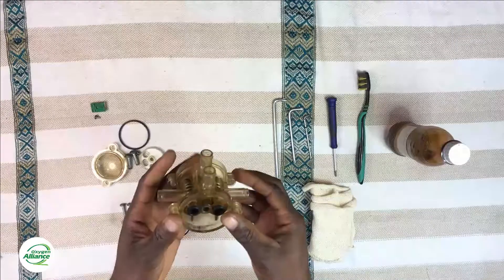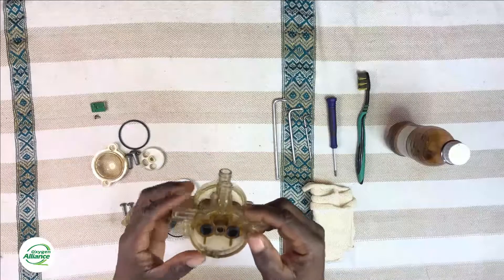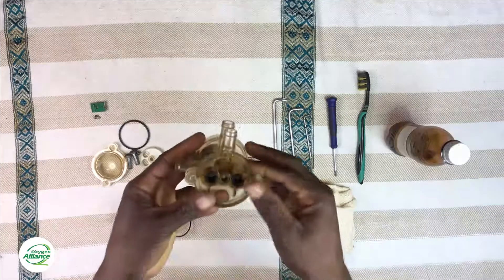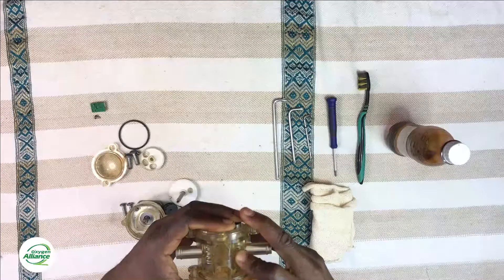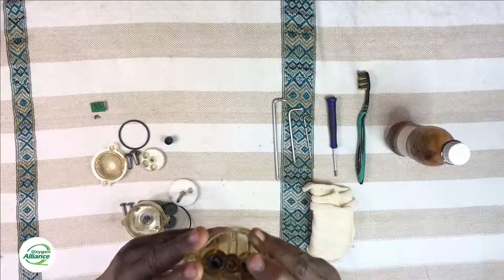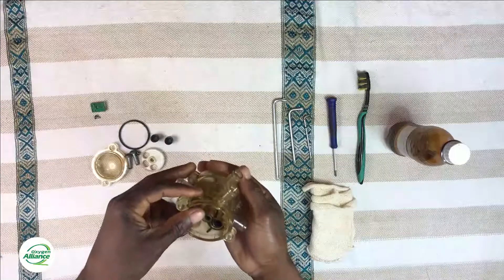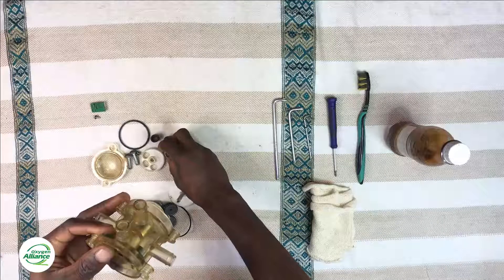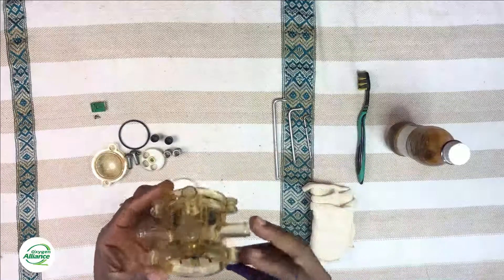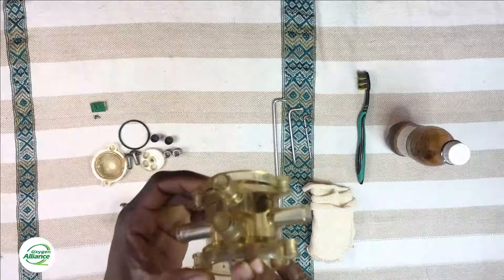After you remove the o-ring, move on to removing the spring holders. We have two spring holders on each side — two on each hole. Just push on one side and the spring holder on the other side comes off. Make sure you do it carefully because sometimes there is some tension on the spring. Then the spring just slides off, and to remove the spring holders on the other side, use a flat screwdriver to push from the other side.